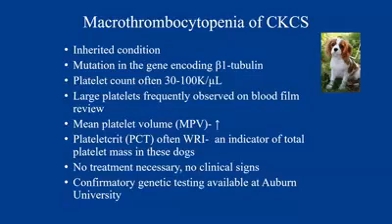Especially for this last case, every year we get a couple of Cavalier King Charles Spaniels that are referred for low platelets and potentially immune-mediated thrombocytopenia, okay? Something to remember, immune-mediated thrombocytopenia, they generally have pretty dramatically low platelet counts, like 10,000 or less. But certainly they can be in the 20 to 30 range. But we get patients referred for concern for either immune-mediated thrombocytopenia or potentially anaplasma infection, but they don't actually have this. They just have macrothrombocytopenia of Cavalier King Charles Spaniel, okay? And so it's another important morphologic change that we can identify by doing a blood film review.